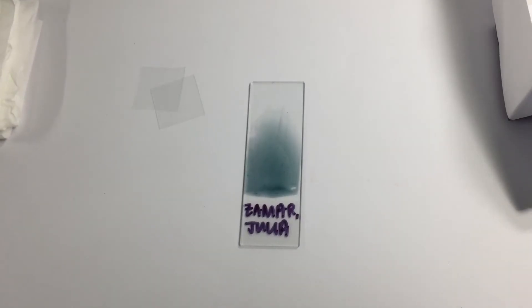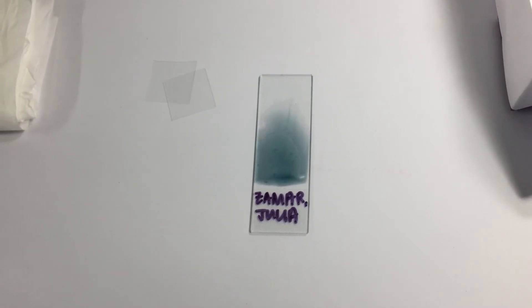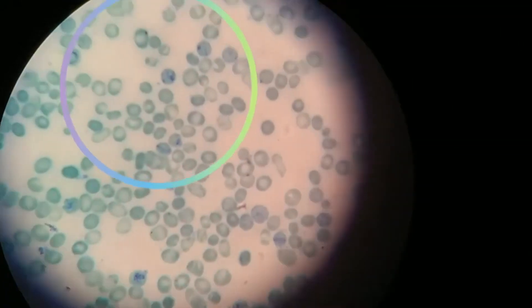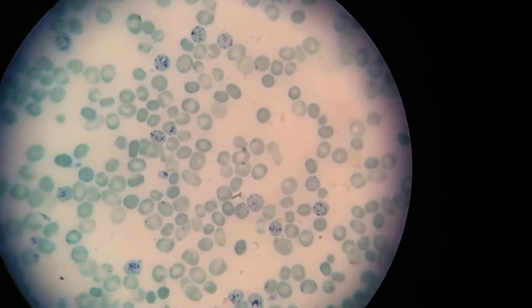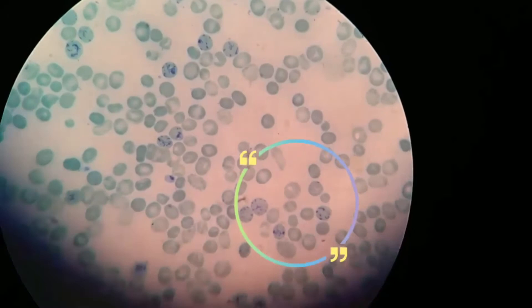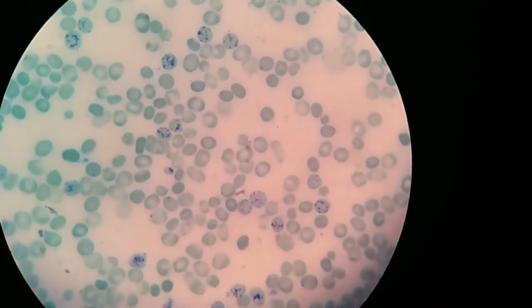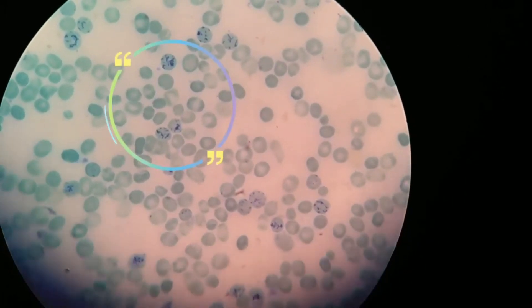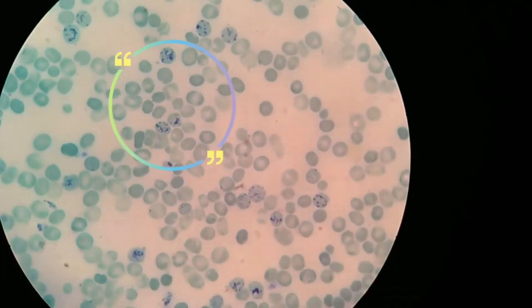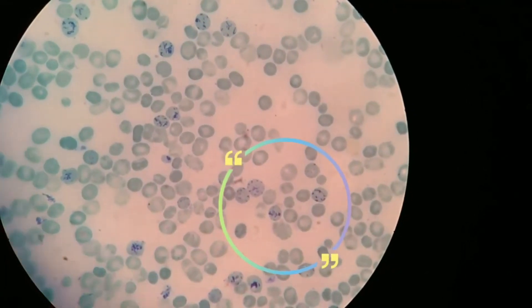After your slide has totally dried, you are now ready to examine it under the microscope using the oil immersion objective. This is how your reticulocytes would appear under the microscope. Like mature red blood cells, reticulocytes do not have a cell nucleus. They are called reticulocytes because of a reticular or mesh-like network of ribosomal RNA that only becomes visible under the microscope when using a supravital stain, which in this case is the Brilliant Cresyl Blue.